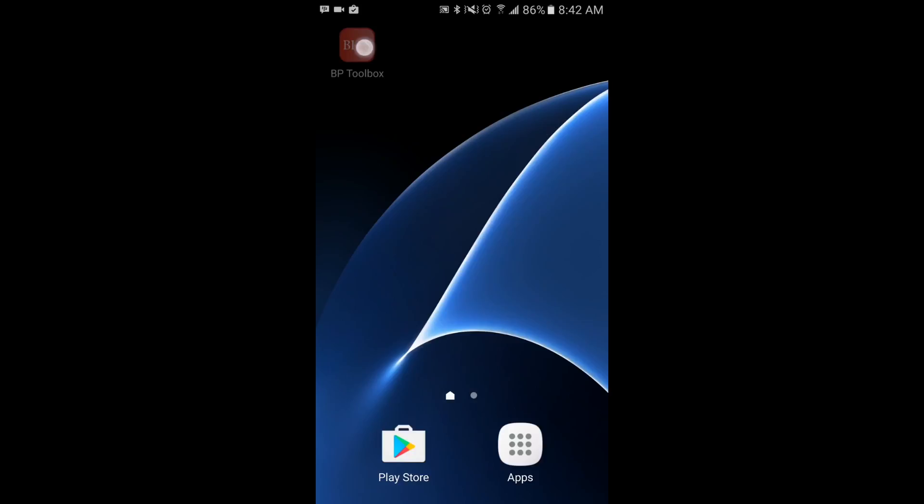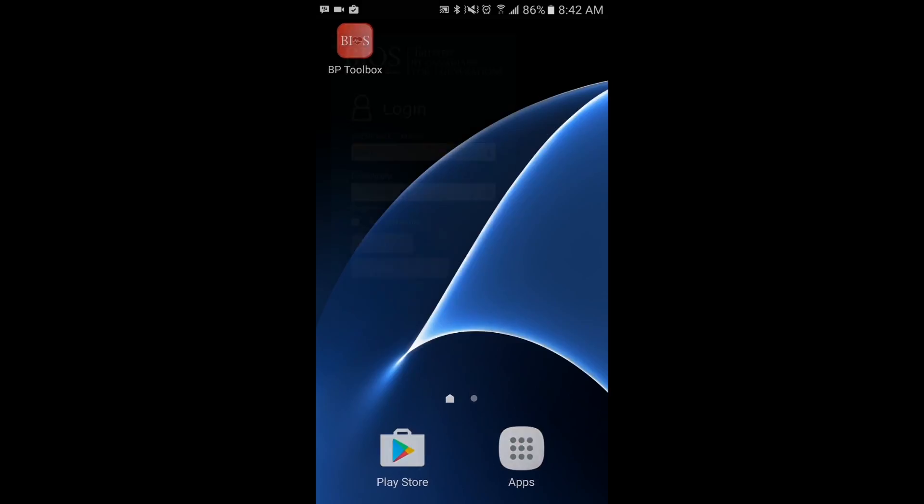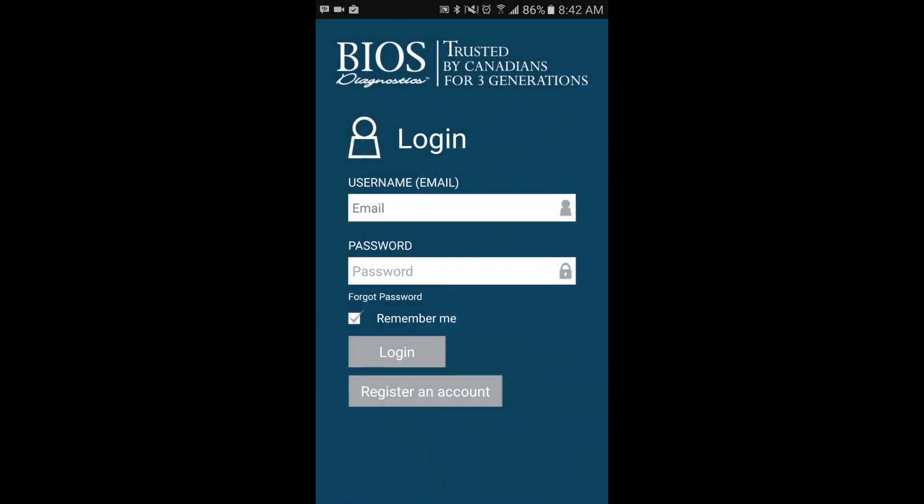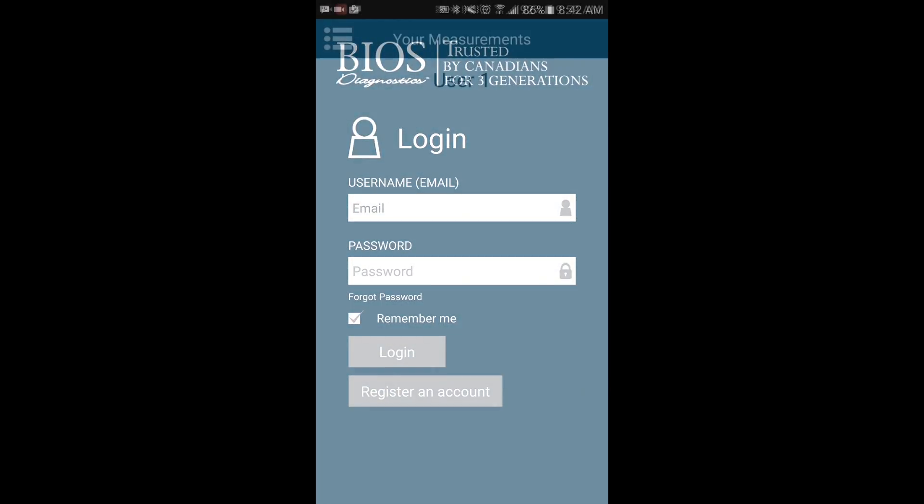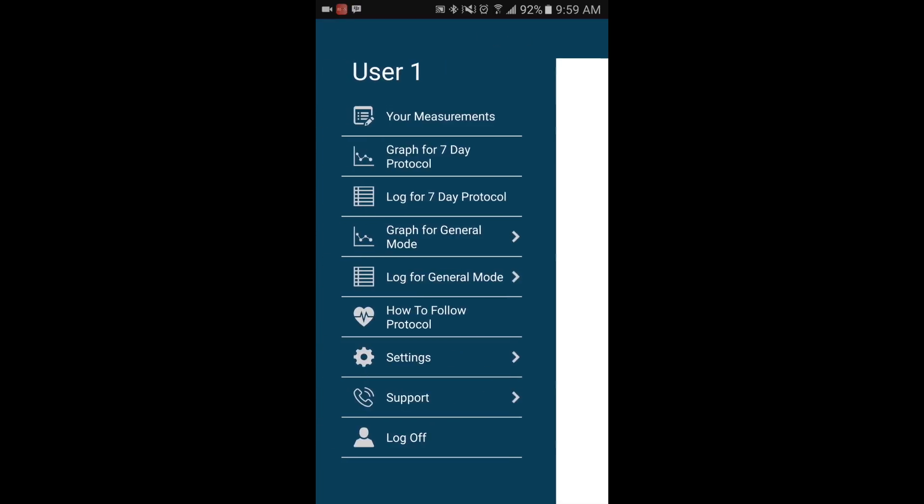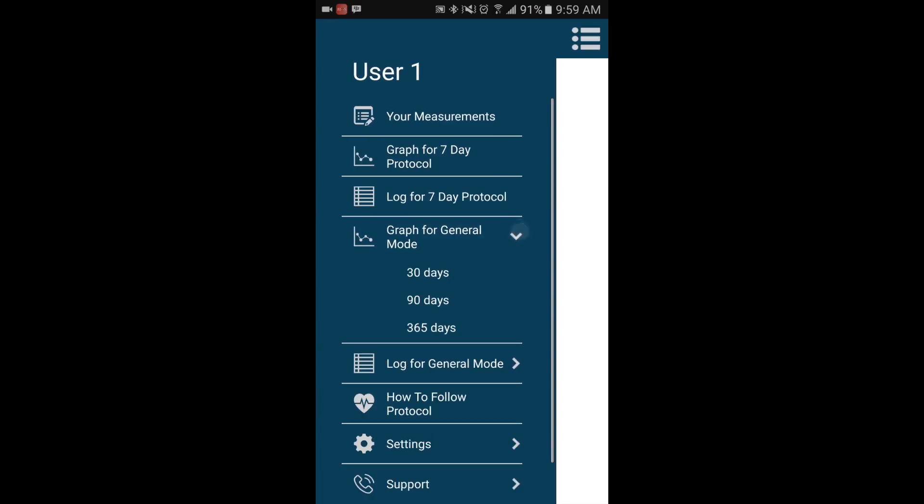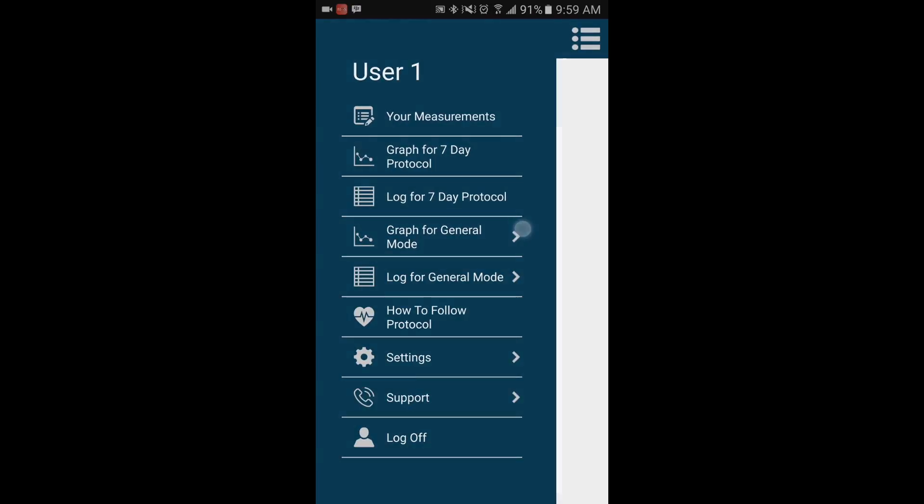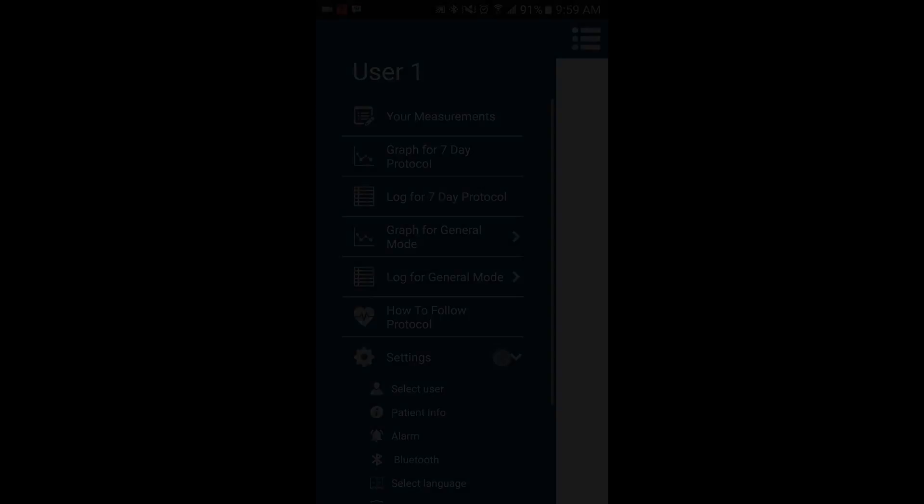Hello and welcome to this video tutorial on how to use the BP Toolbox app. Tracking your blood pressure is easier than ever with the app's user-friendly interface and modern technology.